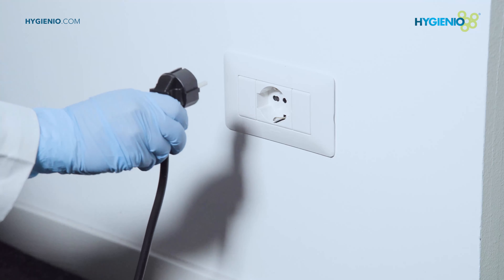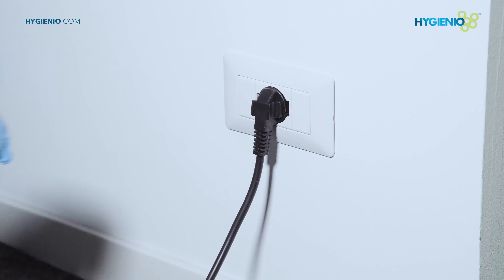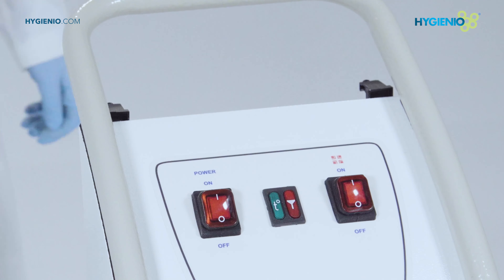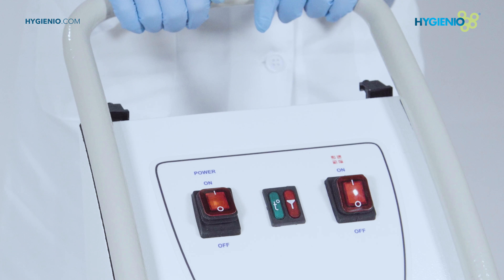Connect the power plug into the power outlet. To start the disinfector, press the power button to on on the control panel.